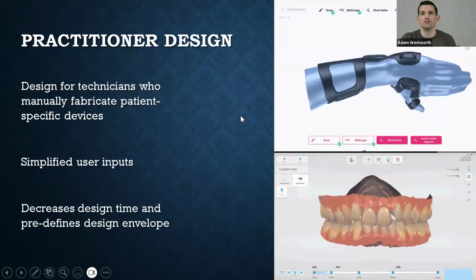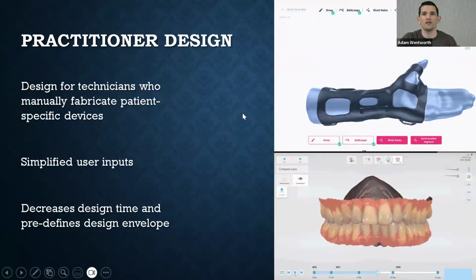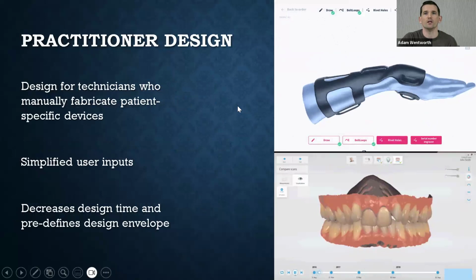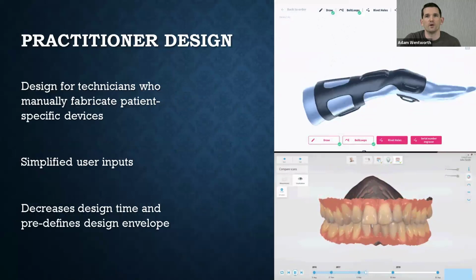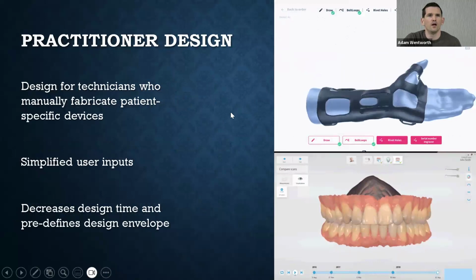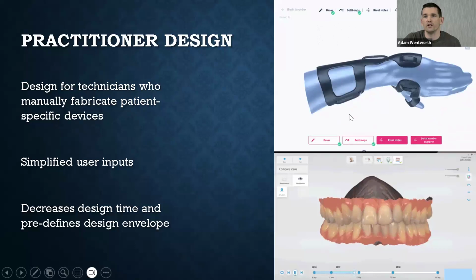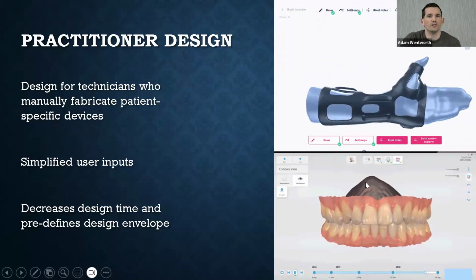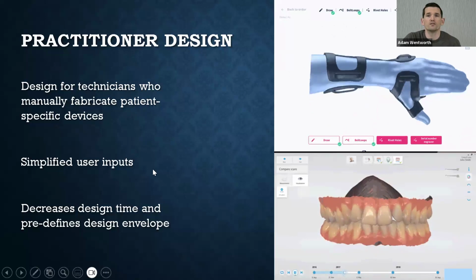Very interesting. Here's an example of some things we do with design not done by the engineers, they're done by practitioners. So some software tools are enabling novice users to get involved in the design phase of these medical devices. Currently, we're doing splints. Our dental specialties are using intraoral scanners. These videos are not my own, so just be aware that they're from third parties. But the general theme is that we're simplifying user inputs.